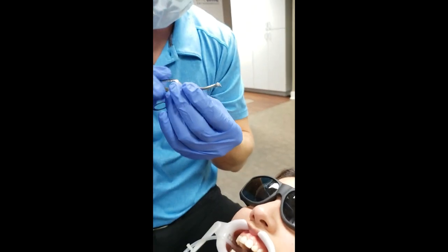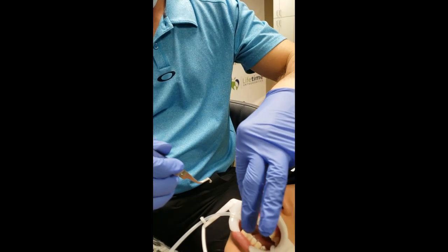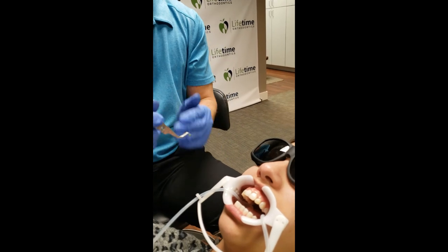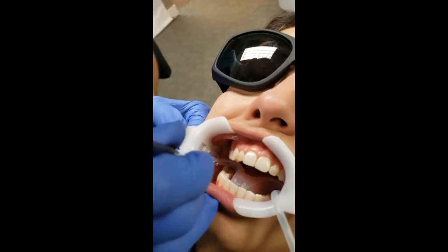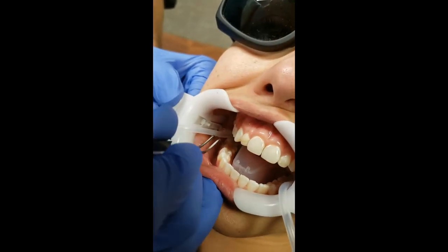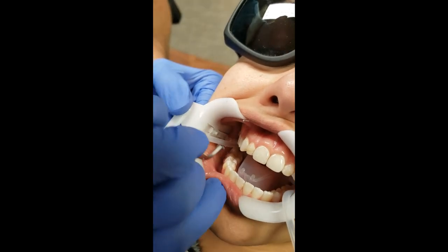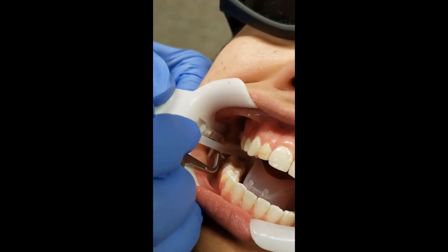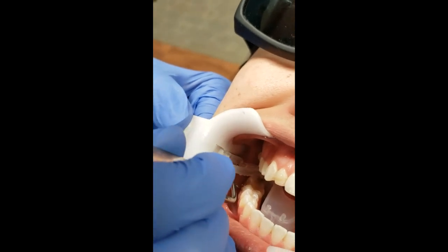You can see why I like it like this - the hook goes backwards. If we're wearing the elastic from the canine to the molar, you want that hook to be right in that line so the elastic holds on well. I'm going to put it on there. This is one - unlike brackets where you want just the right amount of adhesive - where I like to do a little bit extra. Look at that hook up to the canine; that's about the angle we want.